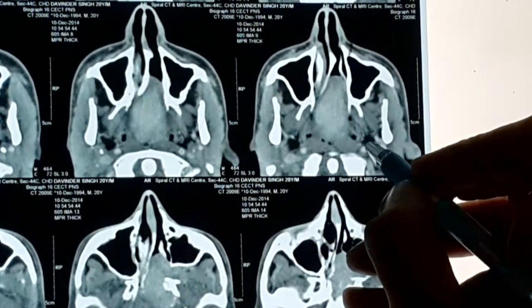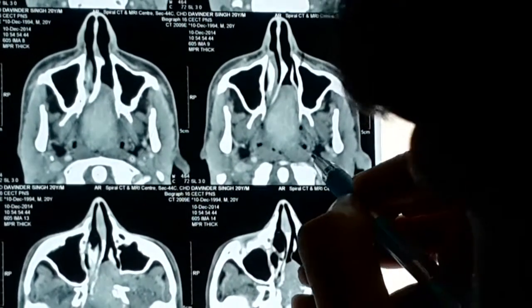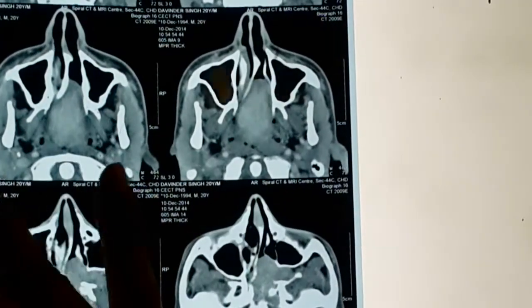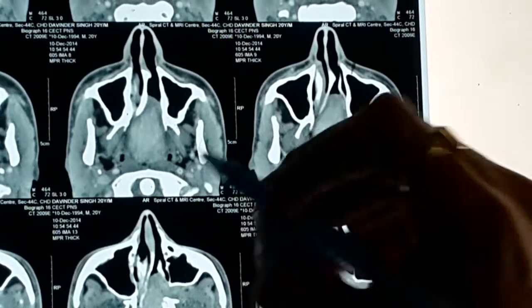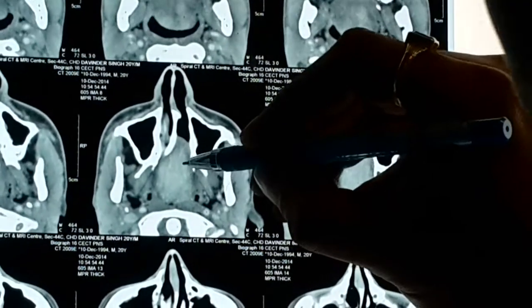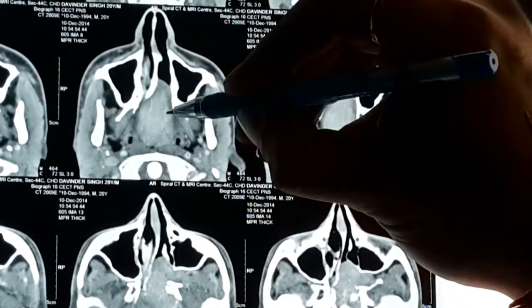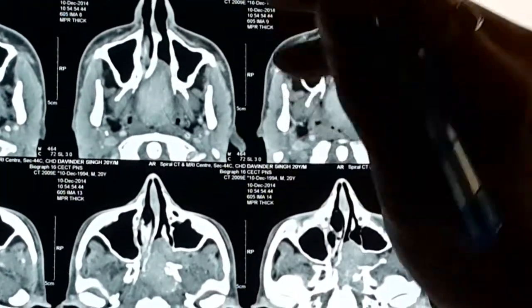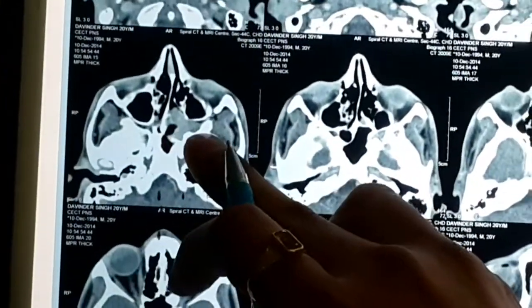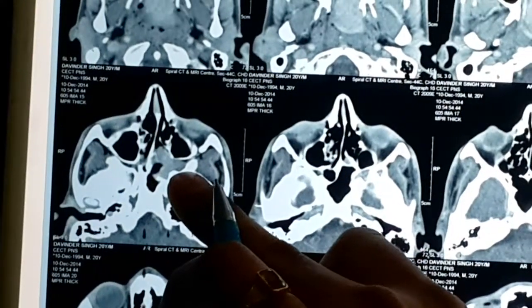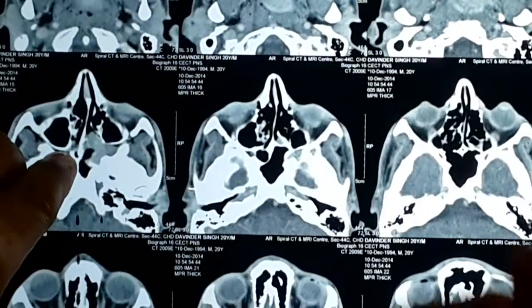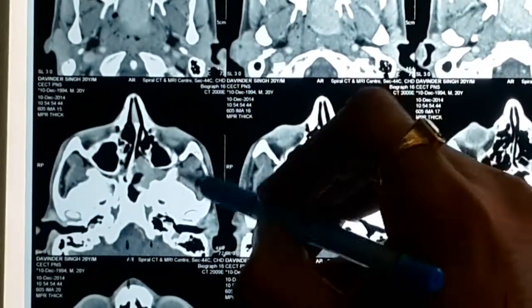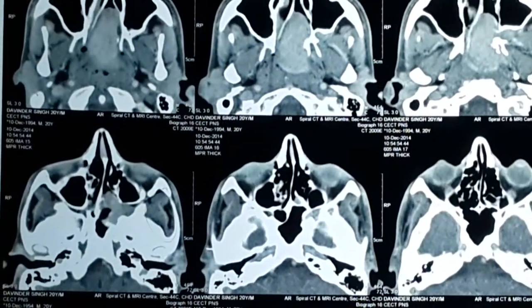Behind, that relatively dark space is the parapharyngeal fat. The black spaces. Your eustachian tube — you won't be able to visualize it. This is the carotid artery. The next case is going up to the carotid artery, extending like this. Going up — this tumor is going into the infratemporal fossa. See, it's limited here, not going into the infratemporal. This is normal fossa. This is the infratemporal fossa — it is not going into the infratemporal fossa anywhere.